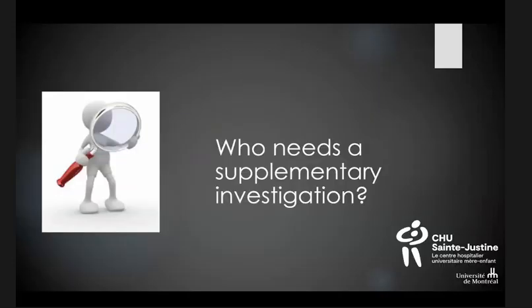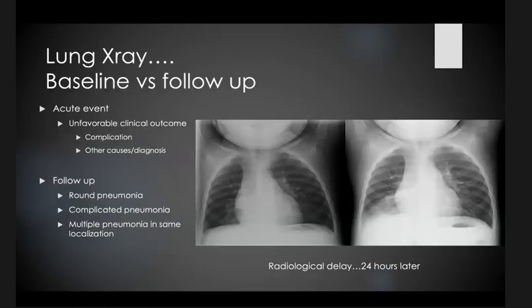So who needs a supplementary investigation? Who needs more than just an x-ray? You can do another x-ray, especially if you have an unfavorable clinical outcome, like if the baby or the child doesn't get better, or if you suspect some complication or some other diagnosis or cause for the symptoms of that patient.